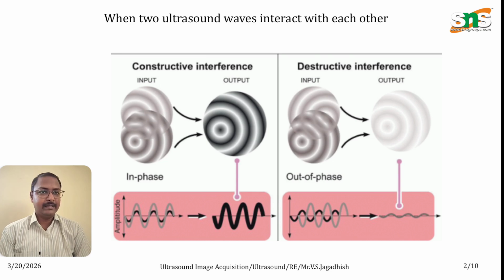between the sound waves. In destructive interference, two consecutive waveforms are out of phase. As you see in the highlighted block, there are two sine waves, but each starts at a different angle and they are out of phase with each other. When the dark line is at its maximum amplitude, the lighter line is at its minimum amplitude. When you add these two sine waves together, we have a loss of signal, or minimum signal. We call that destructive interference. So in imaging, constructive interference is always preferred to have a better resolution image.